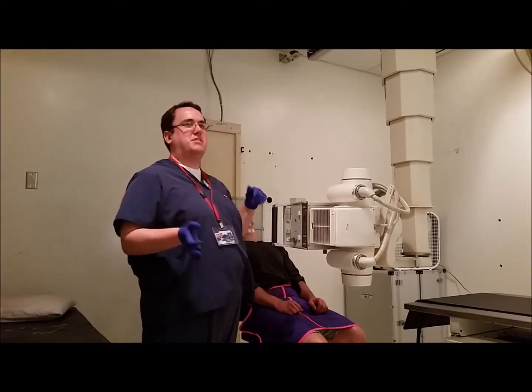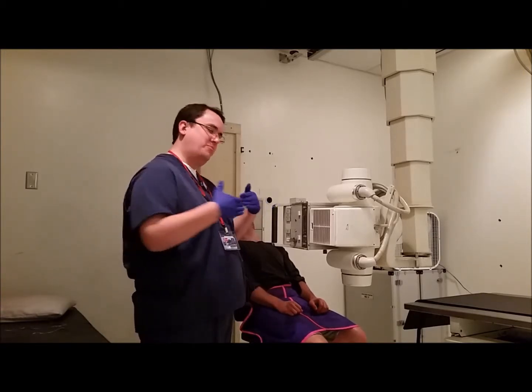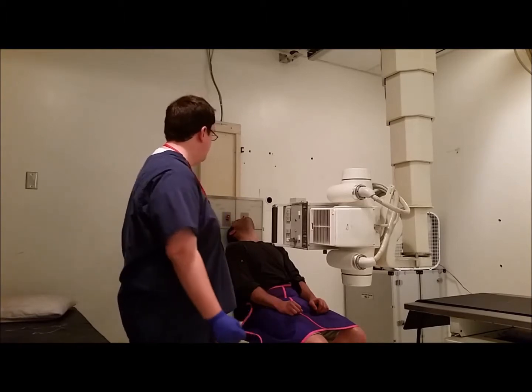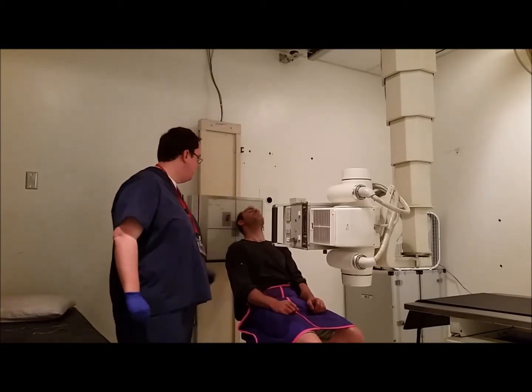All right, and for this, we're going to up the technique a little bit more, so maybe 75 at 14 or so, going through a bit more tissue this time. All right, sir, hold your breath. Click. All right, and you're all set. That's it. You're done today.